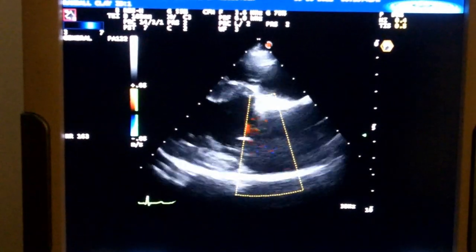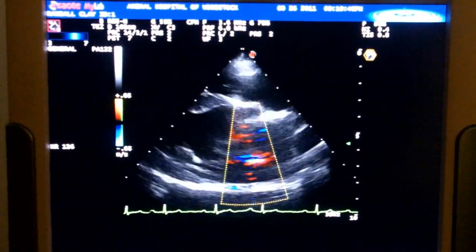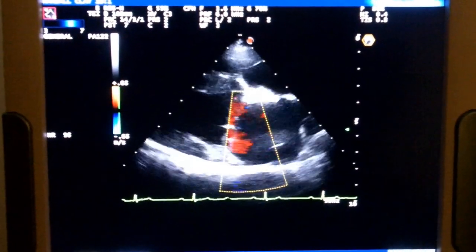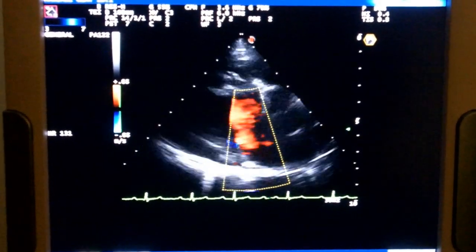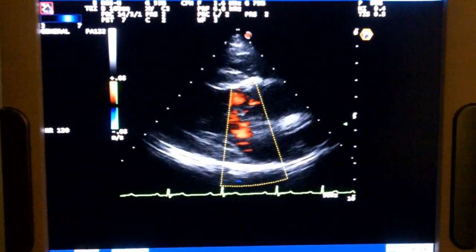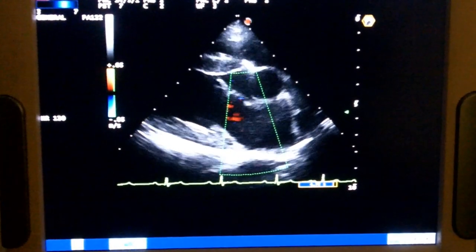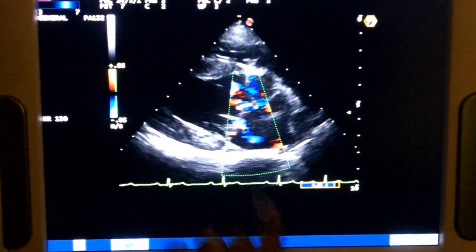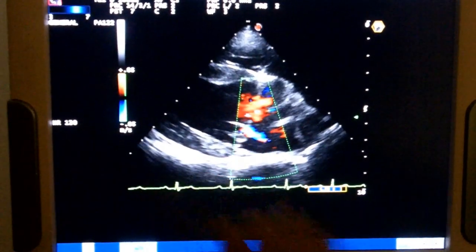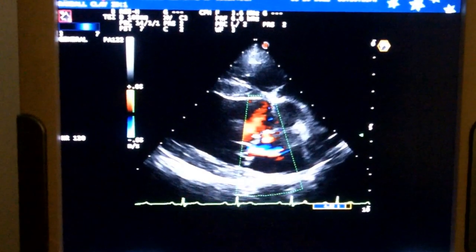In this plane, we'll go ahead and put some color there and see if we can pick up anything. And there is a lesion right there. We do have some mitral regurgitation that you can see fairly clearly. You can see the valves open here, and when they're closed, we're picking up a signal that indicates some retrograde movement of blood, or some regurgitation, and that will produce a heart murmur and also produce an enlarged left atrium.